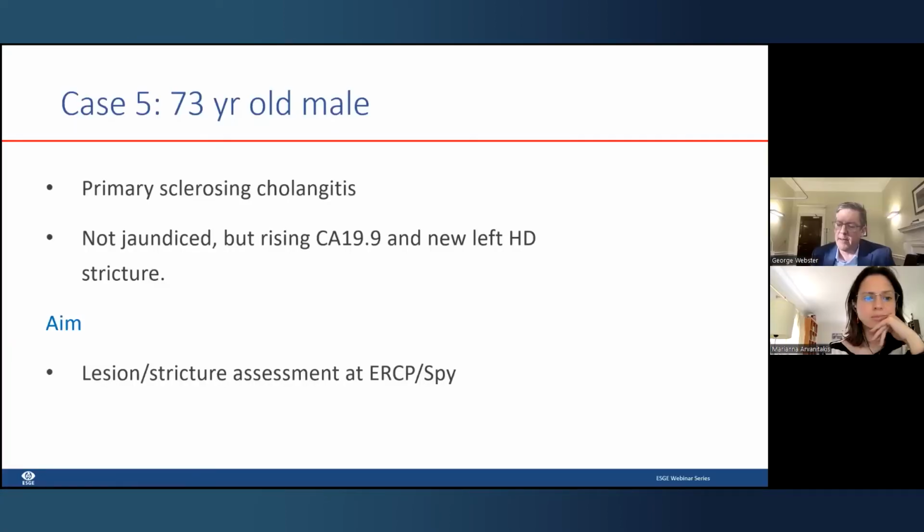And certainly, as Gavin says, surgery for Mirizzi syndrome is a real challenge, and the surgeons sometimes find that they're having to do a bile duct resection or bypass, and they very much are favouring us going with cholangioscopy as the index intervention. Okay, guys, great discussion. You'll be back with us in a bit, but we are creeping up the bile duct now, and let's go for our fifth case.